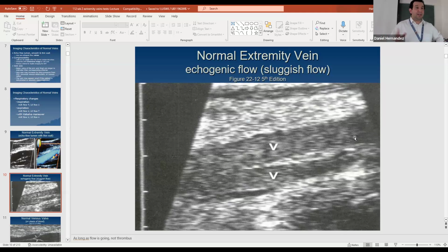They just read it out as negative, didn't mention anything about this to the doctors. And then she comes back a week later, both legs completely thrombosed, DVT up and down both legs. And I'm just like, oh God, and I was the one who did her follow-up scan, and it was a little frustrating at that point. You share that with the doctors, and then they don't heed your advice as a sonographer.